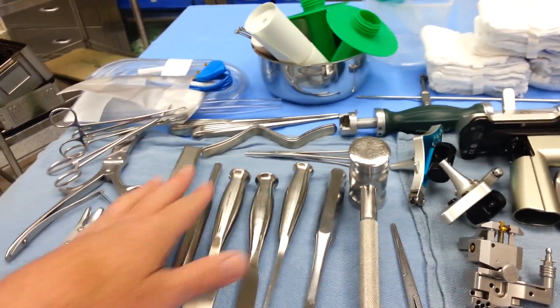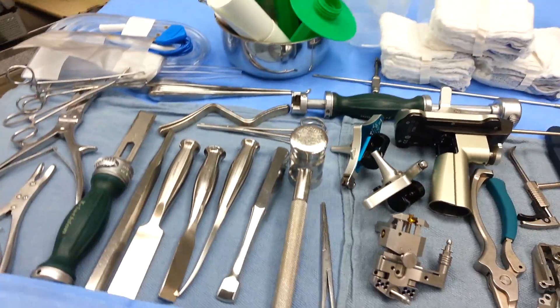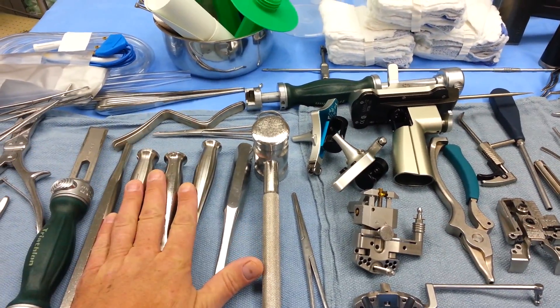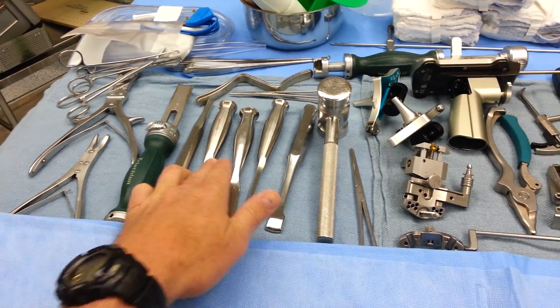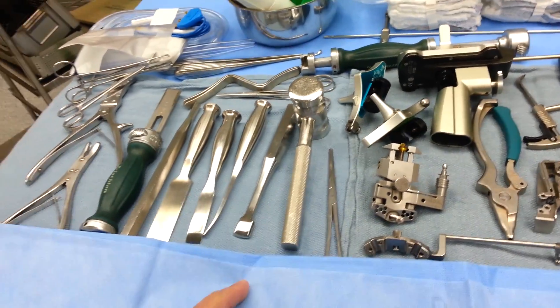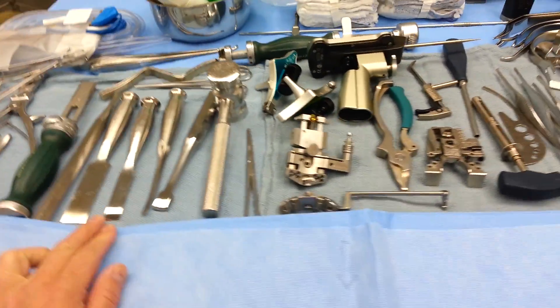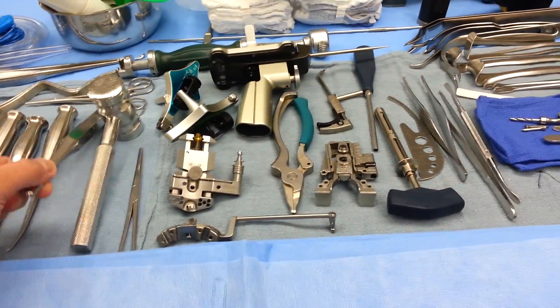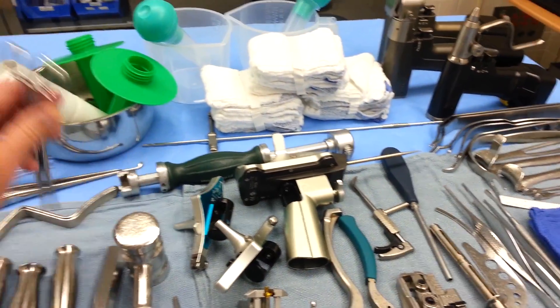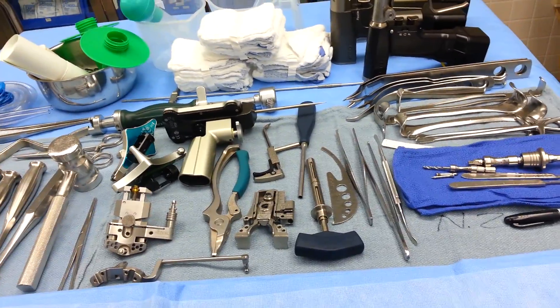Z retractors. Two different size curettes — you have the other ones over in your major bone tray if you need them; generally we can get away with just two, a small and a larger size. Osteotomes here — most surgeons use a large one for popping the tibial bone cut off and then grab it with a Kocher, so we have a Kocher here. We use a quarter inch curved osteotome often and either a half inch or five-eighths one, often two, for osteophytes. Bone wax is always good to have up in case you need it, as well as an elevator. Some physicians like to use Kochers to hold retractors in place with the bandages.